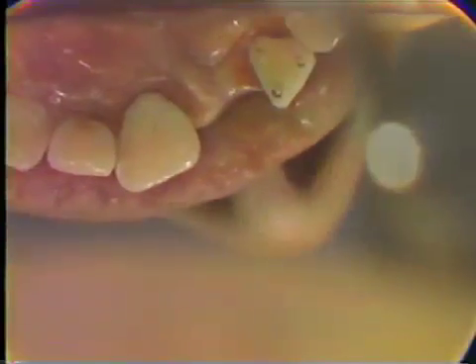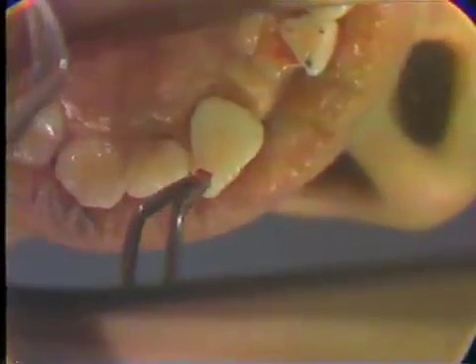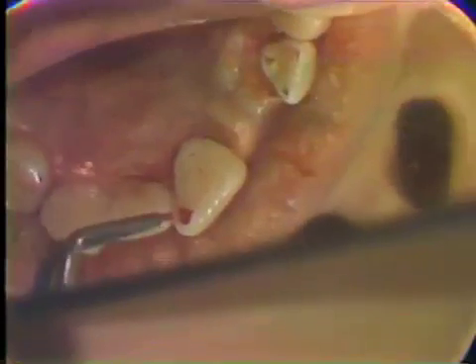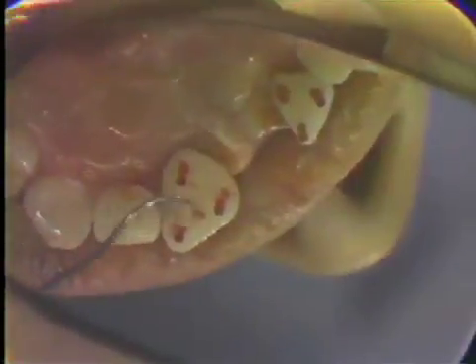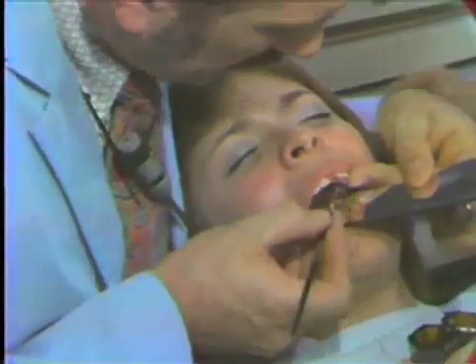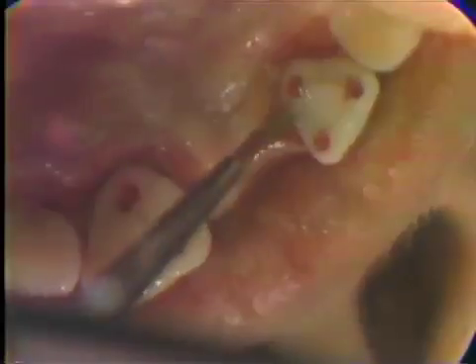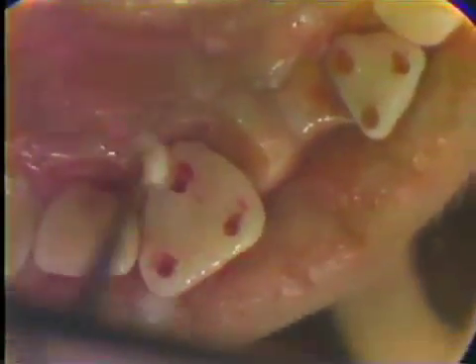The next thing to do is to temporize. We have to seal the pin holes so that saliva and liquid monomer do not get down the pin holes. We'll use Williams plastic pins that have been dragged in utility wax — the red wax — and this utility wax will seal the Williams plastic pin. The excess utility wax is removed with an explorer, but there still is a seal or gasket around each of those pins. Then we'll take tooth-colored Duralay, shade 62, and paint it on the lingual surface, tying the three pins together. Be careful not to use too wet a mixture or it'll run all over the gingival tissue. Build up the lingual surface and also over the incisal edge to protect the delicate incisal.